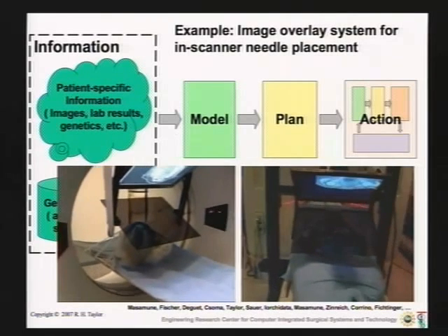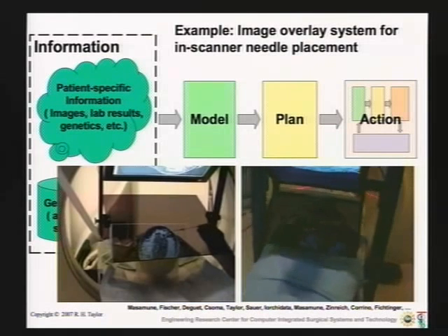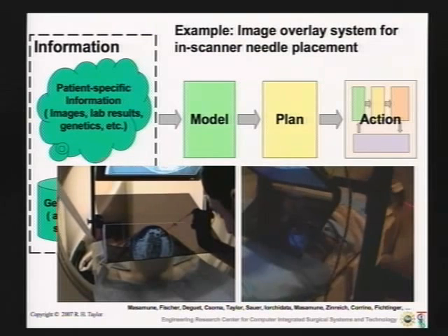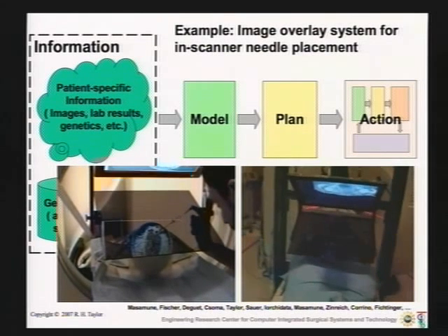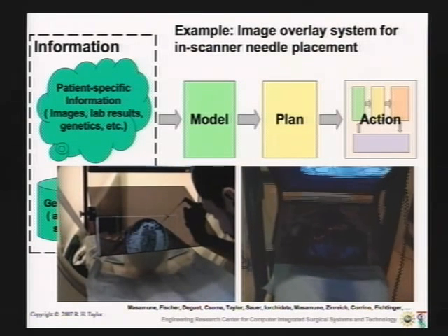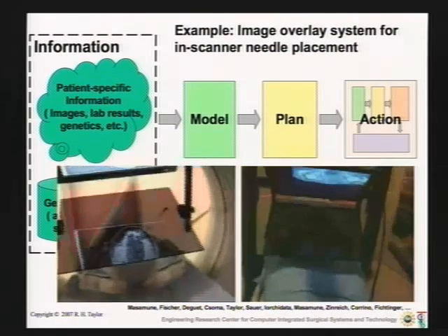The vegetable, that's a melon. The Vegetable Care and Use Committee had no objection, and it was a fast approval. This is the current system. This is an MRI-compatible version, and it's just going into clinical testing for perispinal nerve block procedures.